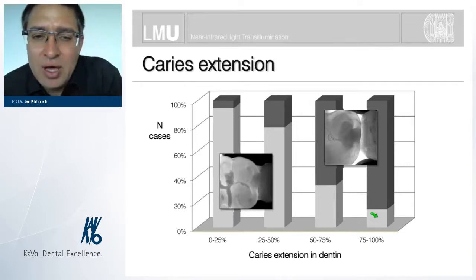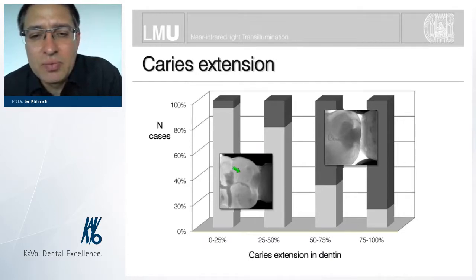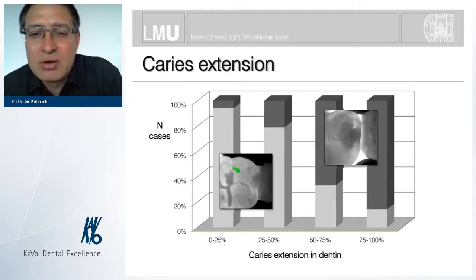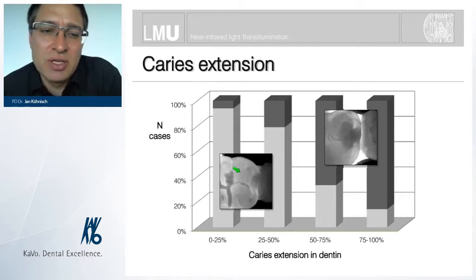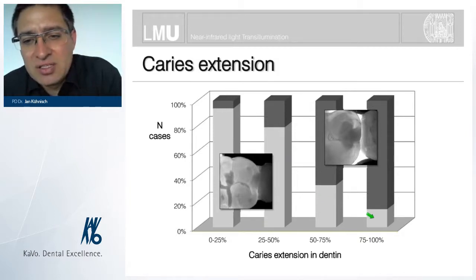And you see from the distribution, the grayish areas are those cases with no direct visibility of the dentine caries process. It means that those lesions are located more or less beneath the enamel dentine junction, but the number of lesions decreased as deeper the caries process was.